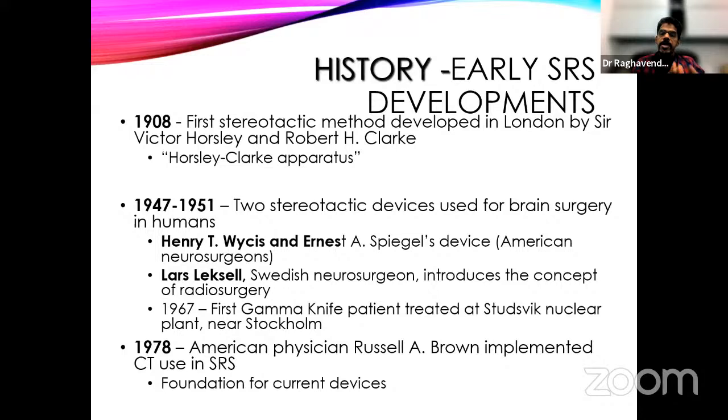The frames used basically for neuronavigation systems are stereotactic frames. Apart from radiosurgery, they are used very well in the neurosurgery field, even for functional neurosurgery or biopsies. They use this kind of frame-based work, the neuronavigation, to reach a specific nerve with precision so that they can perform surgeries on that particular area.